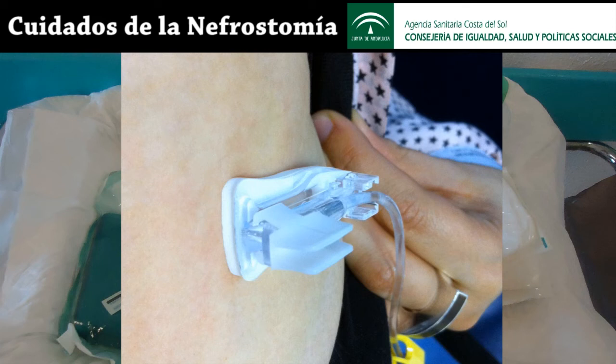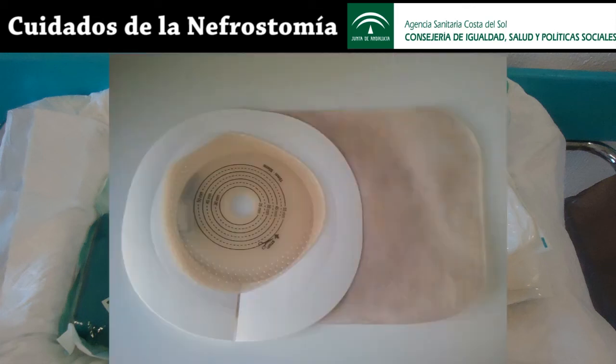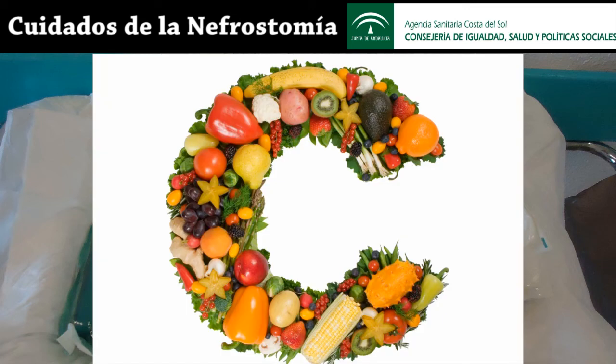Mobilization. Avoid sudden movements that may tug on the tube. It is essential that the catheter remain as long as it was when it was put in to prevent accidental extubation, despite the silk stay suture. Check to see if the urine tube is twisted or bent. The adhesive disc should be changed every 3 to 4 days. Change the draining bag daily.